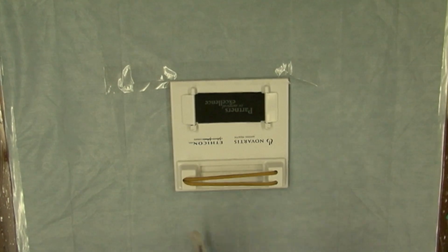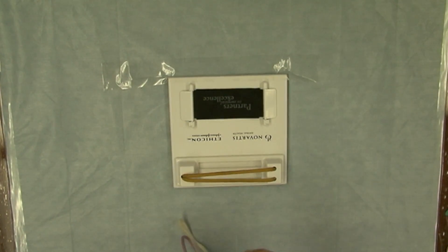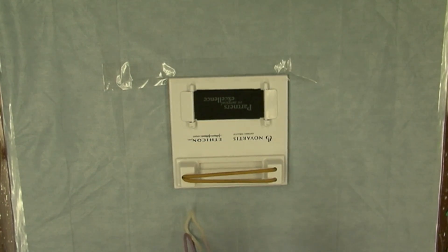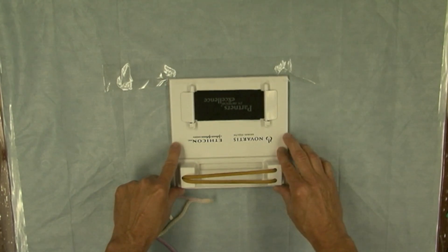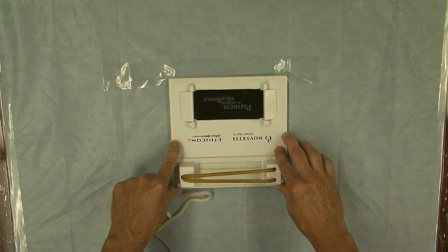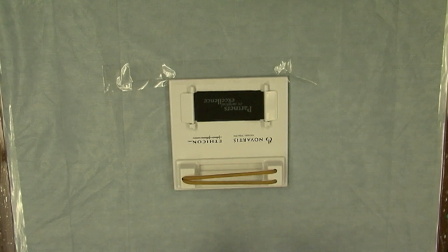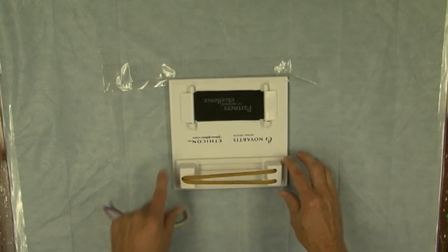I will be demonstrating the one hand technique to construct a square knot using hand ties. Notice that I have the Ethicon knot tying board actually upside down, so this portion of the knot board is toward me.